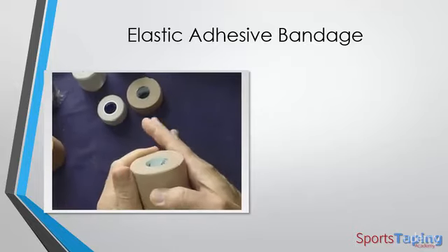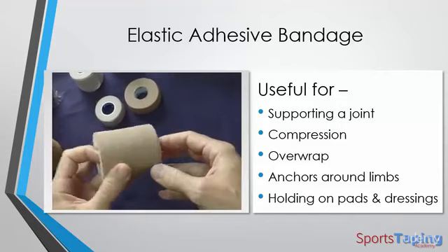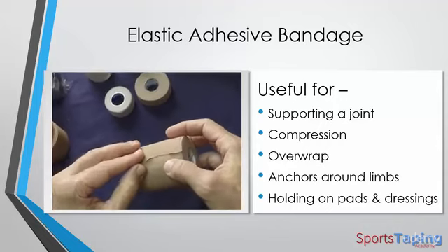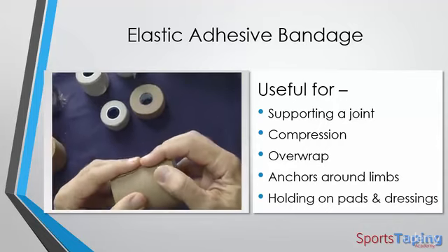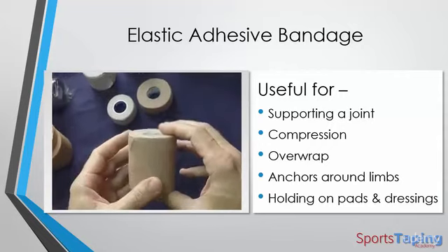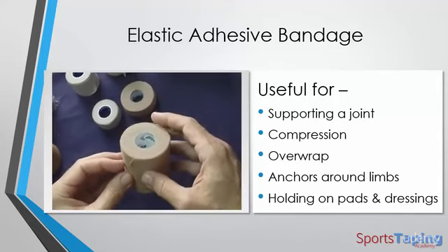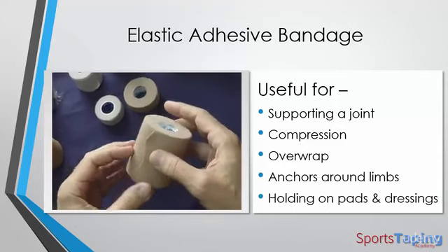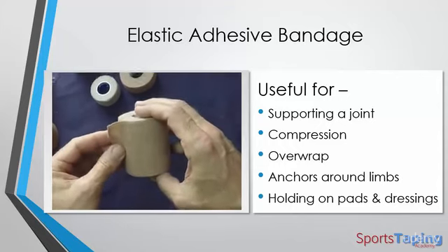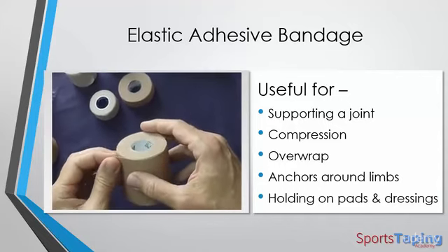So what are the best uses for elastic bandage? Because of its stretch, we don't use it for situations where we have to restrict movement. Although sometimes it's good just to use to give a little bit of support to an area. I also like to use it as an overwrap. So after I've, say, strapped a shoulder, I'll use an EAB tape just to give that little bit of extra softer support. And also helps to hold down the rigid tape that we've used for the shoulder.